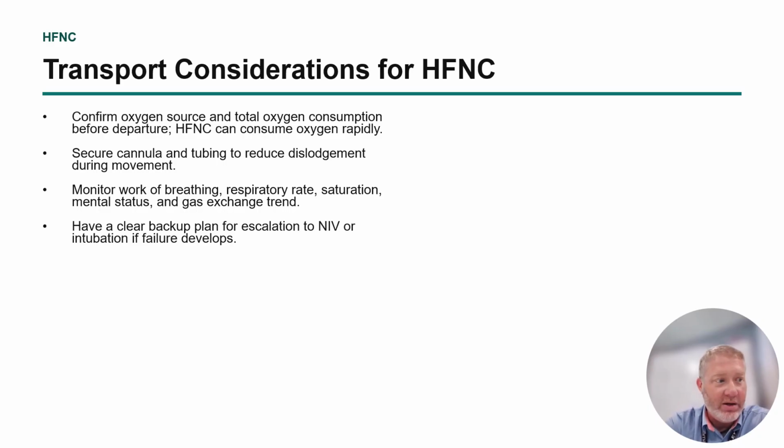So you've got to calculate whether your cylinders or your onboard supply can support that amount for the flow, the FiO2, and the trip length. So understanding the tank equations is super important. If you need a refresher on that, or if you're not aware of that, shoot me a message in Canvas, and I can put something out for those.